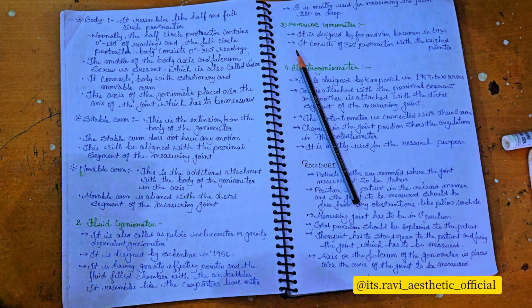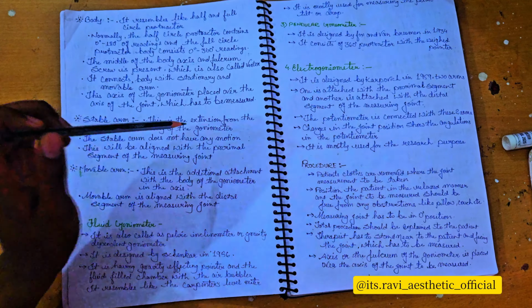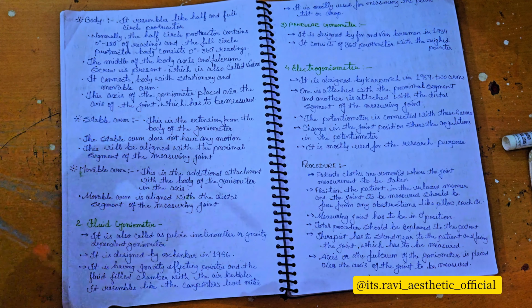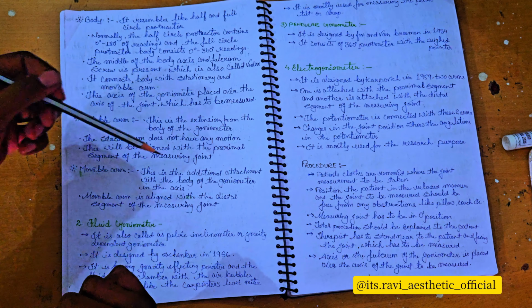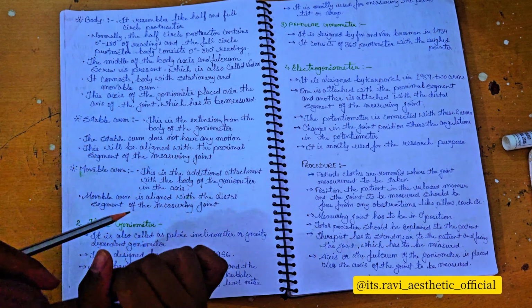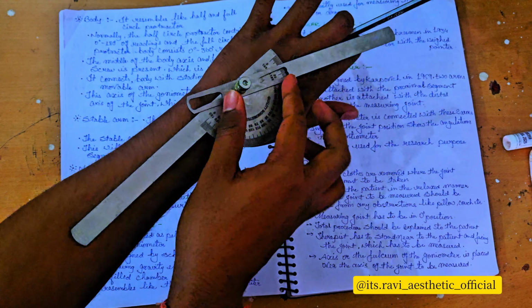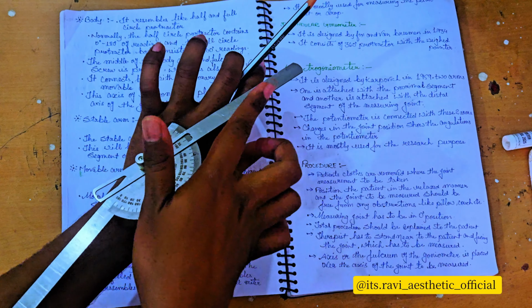So what is the function of the stable arm? This is the stable arm. It is an extension of the body of the goniometer. The stable arm doesn't have any motion. It is stable towards the stable bone, and it is aligned with the proximal segment of the measuring joint. You can see this is the stable arm, and it is proximal towards the body, and this is the movable arm, which is distal towards the body.